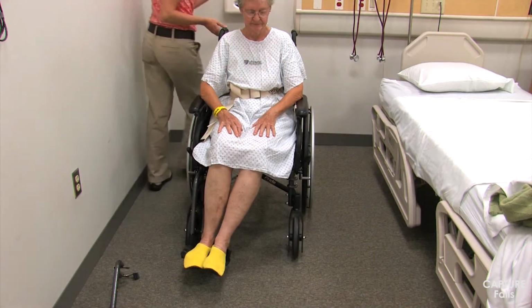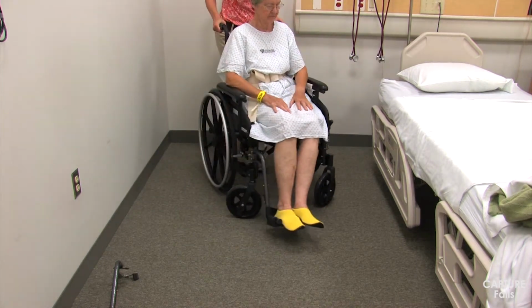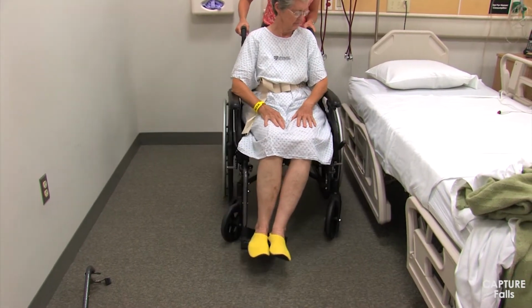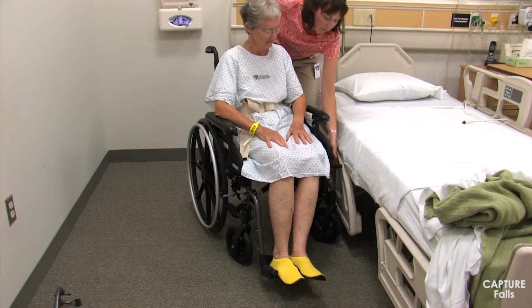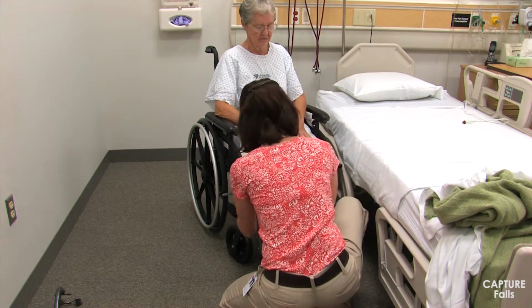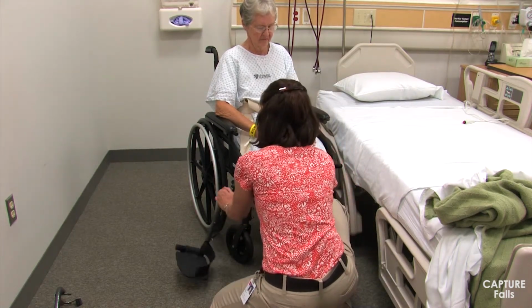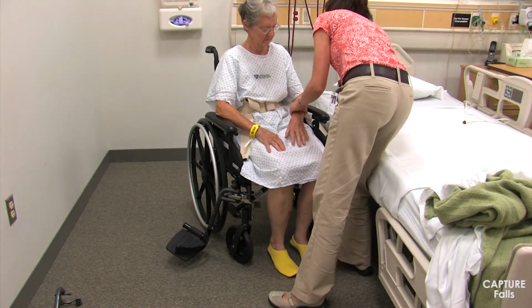Positioning the wheelchair at a slight angle creates a space for the caregiver who is providing the second assist. Make sure the wheelchair brakes are locked before initiating the transfer. The armrest adjacent to the bed should also be removed.